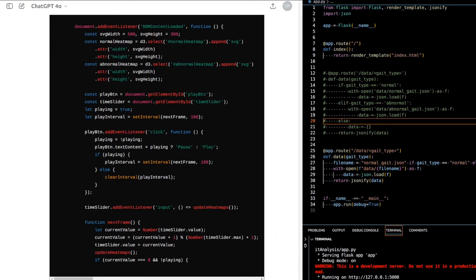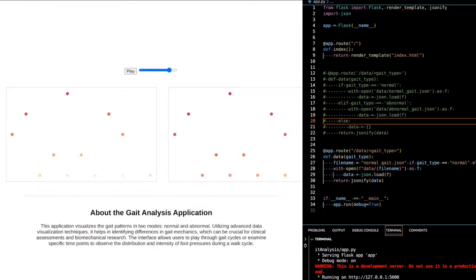3. Spline interpolation. To create a smooth and continuous outline of the foot, spline interpolation is used. This method takes the set of outline points and generates a smooth curve that passes through or near these points, providing a realistic representation of the foot's shape. 4. Plotting and visualization. The model is visualized using 2D plotting, where the foot outline is drawn as a continuous curve and sensors are marked as discrete points. This visualization helps in understanding the distribution and position of sensors relative to the foot's anatomy.